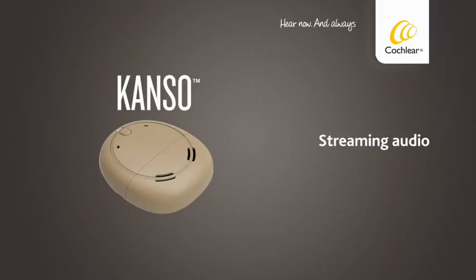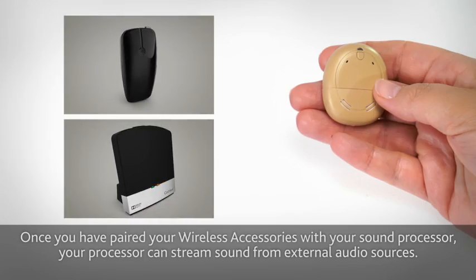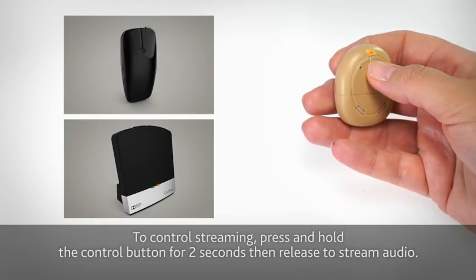Streaming Audio. Once you have paired your wireless accessories with your sound processor, your processor can stream sound from external audio sources. To control streaming, press and hold the control button for two seconds, then release to stream audio.